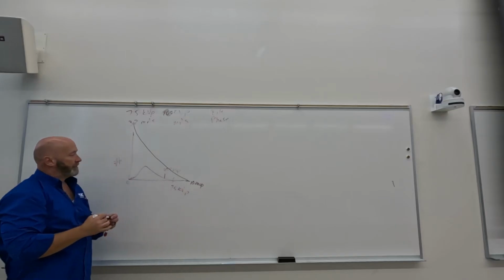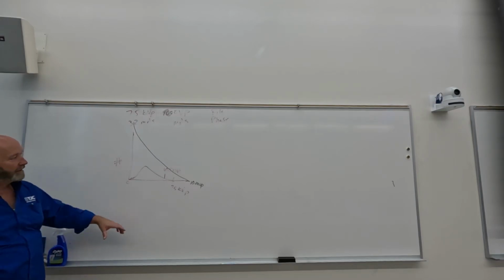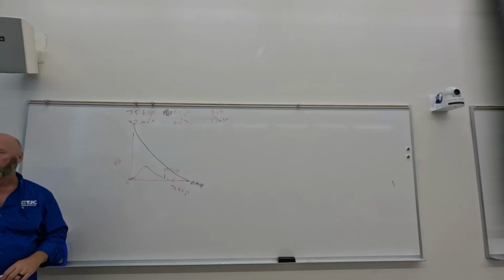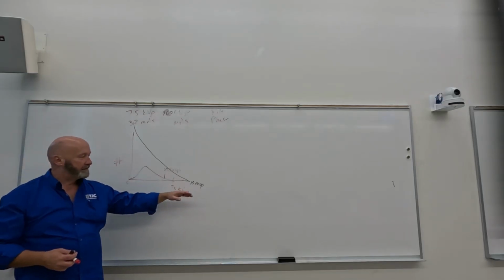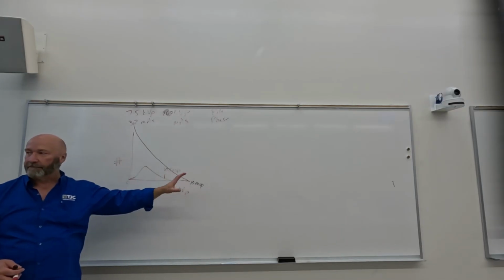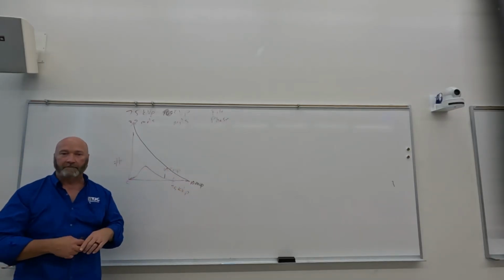Okay, so just immediately before we get to the filtration, what do you see there? If this represents numbers, what do you see there? A lot more, right? So what you need to be thinking is that kVp doesn't just increase the peak energy, but it increases all X-ray creation at all energy levels.